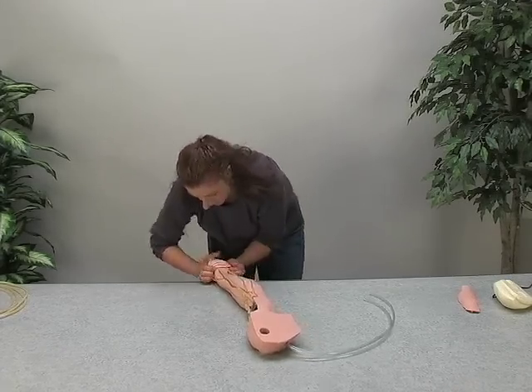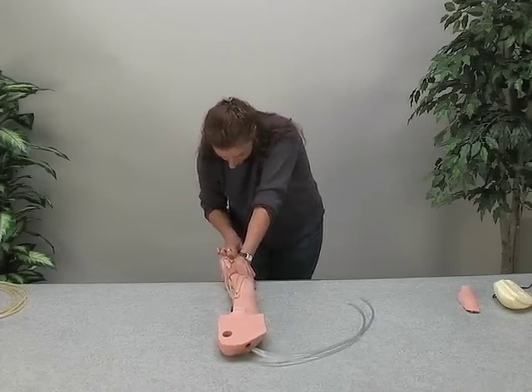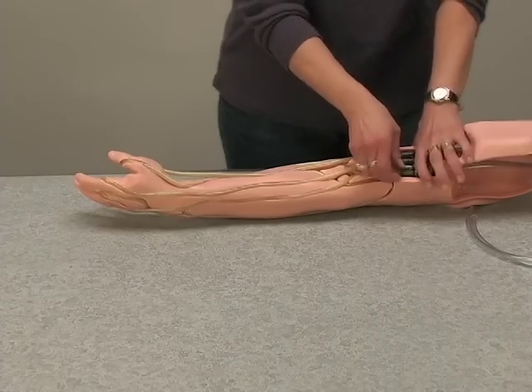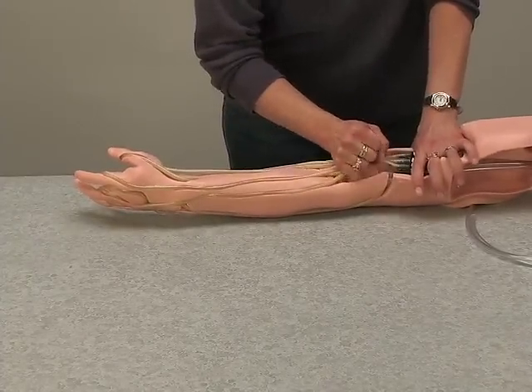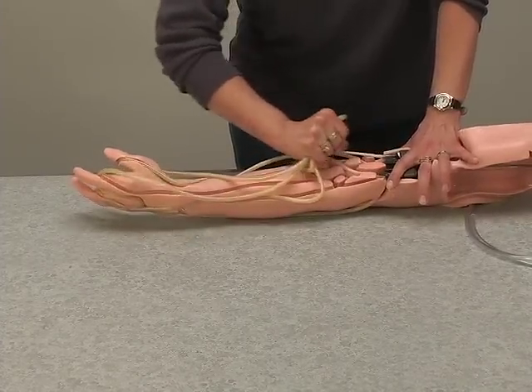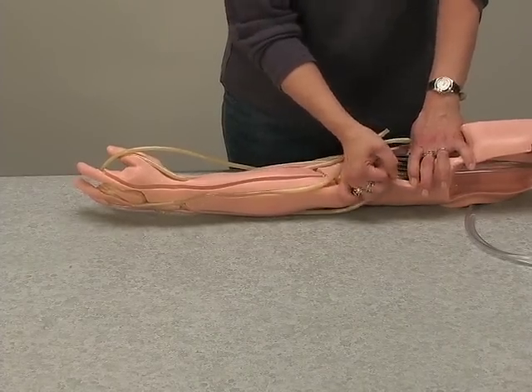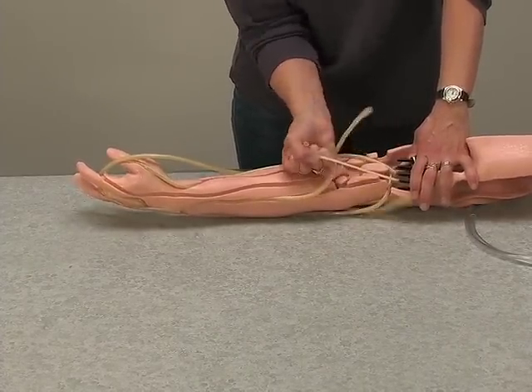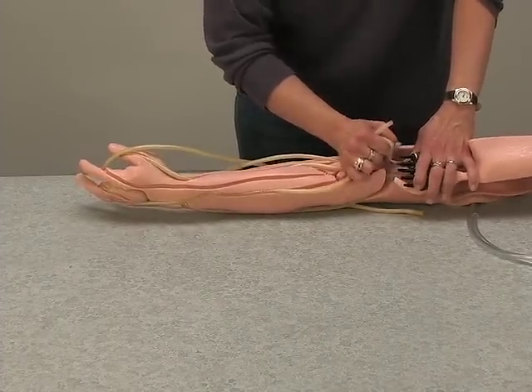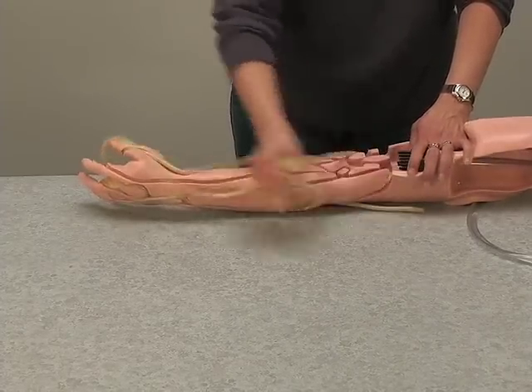Continue removing the skin by moving it over the wrist and fingers. Then disconnect the used tubing from the fittings on the connector block, and detach all of the veins out of the arm vein channels.